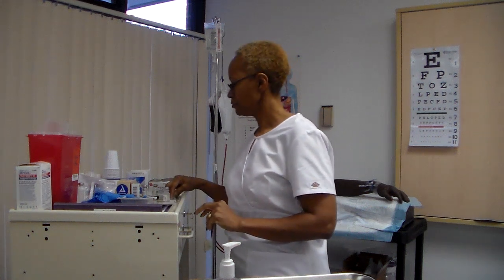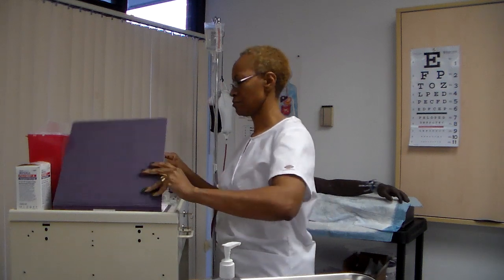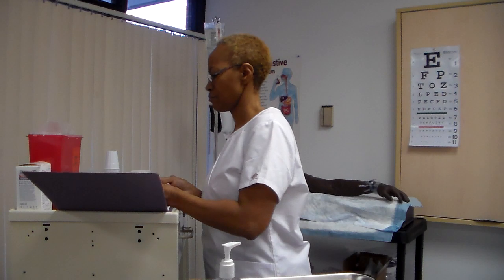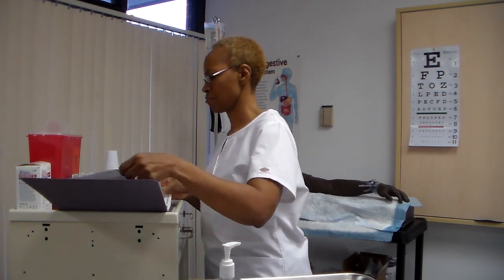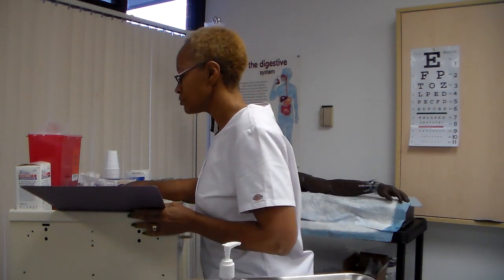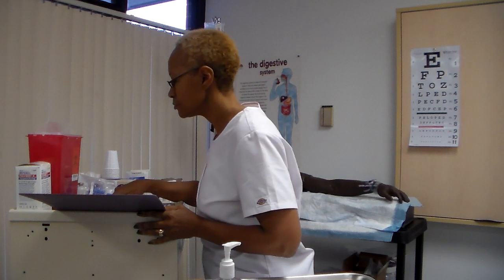Administering medications by intravenous bolus. Check accuracy and completeness of each medication administration record or computer printout with prescriber's original medication order. Check client's name and medication name, dosage, route, and time for administration. Recopy or reprint any portion of MAR that is difficult to read.